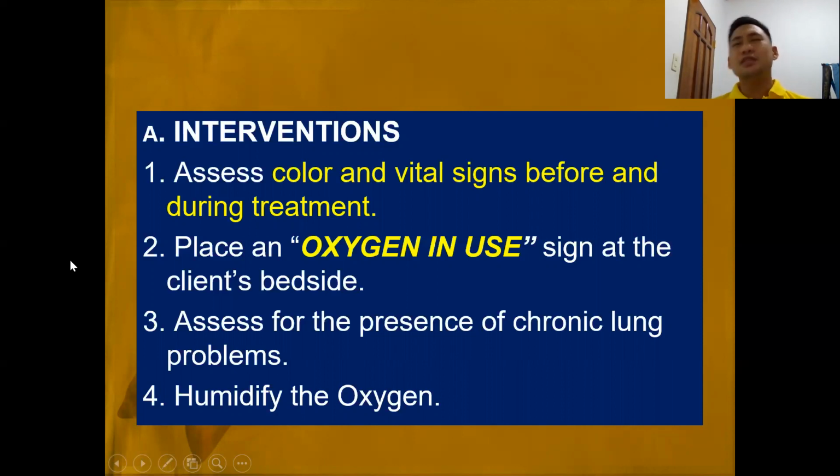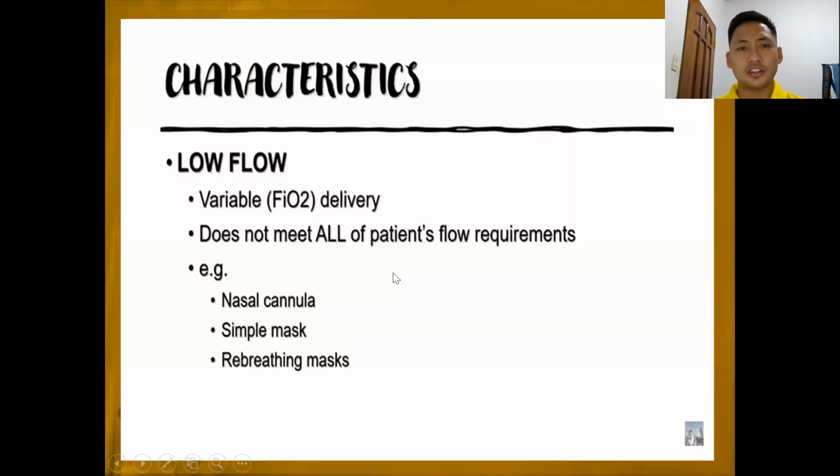And the most important thing to take into consideration, especially if the patient is on oxygen therapy, is to put a no smoking sign in the room or on the oxygen tank if it is not a wall unit device. So no smoking, because oxygen is highly combustible. Okay, it would cause a fire in the room.